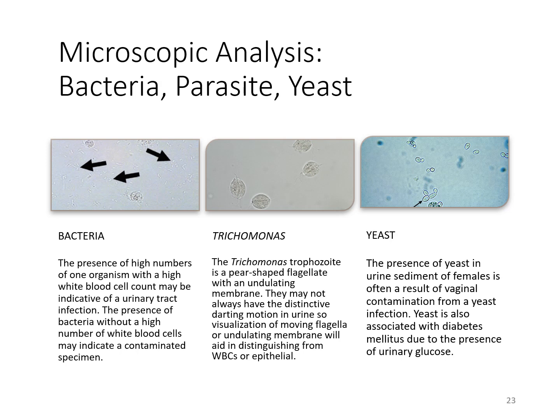The appearance of yeast, of course, yeast bud, but they can be confused with red blood cells. So you're always looking for that mother-daughter cell where the yeast is budding off and pinching off. Seeing yeast in urine can be associated with diabetes, but it can also be a contaminant from the vaginal secretions as well. So making sure that you correlate yeast with your reagent strips is very useful.